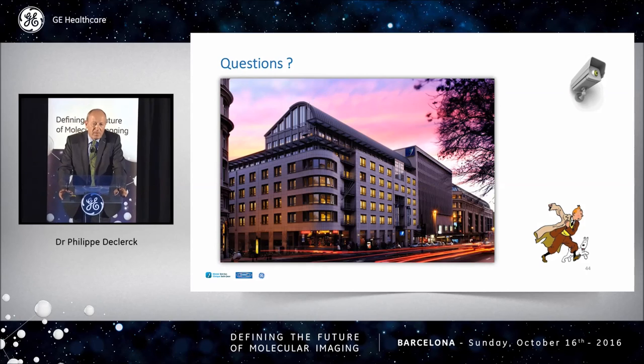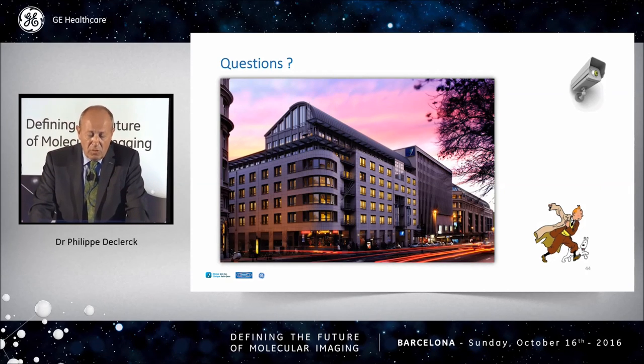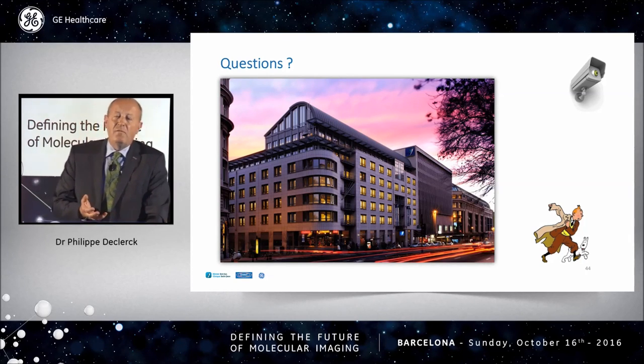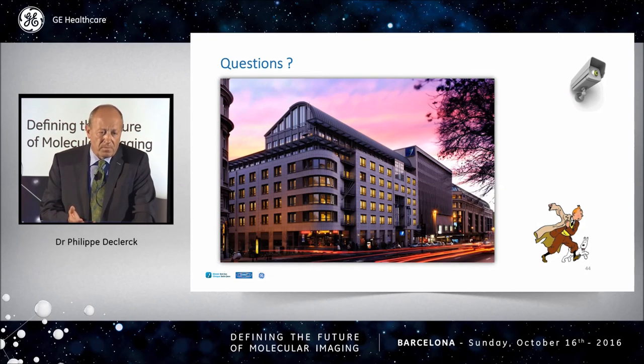our patients. I think for elderly patients and cancer patients or ill patients, we can go for time reduction, because we have to work fast. And irradiation of old patients and cancer patients, that's not an issue. But for young patients, young women and children, there I think we should go for dose reduction. Okay, very clear. Thank you.